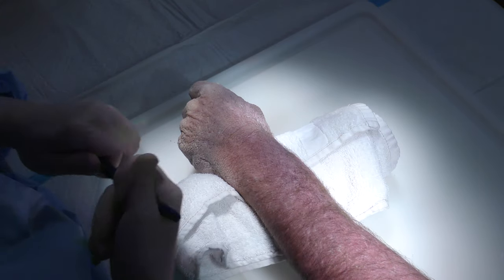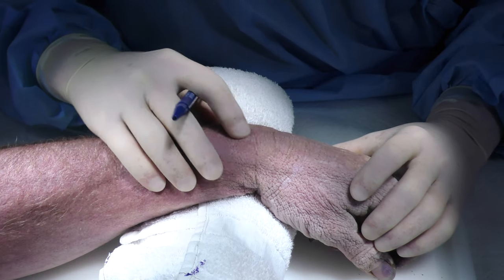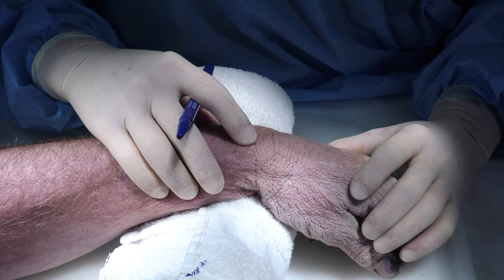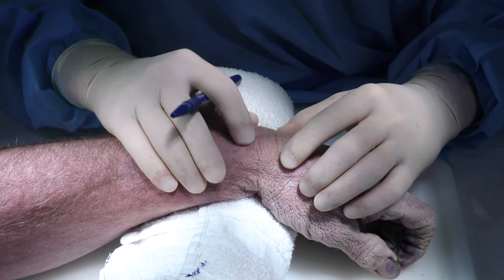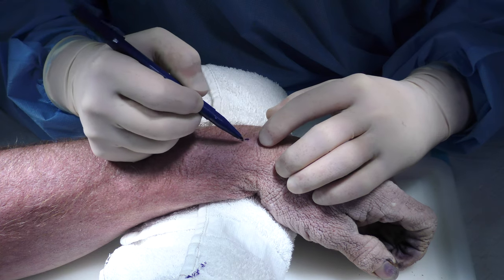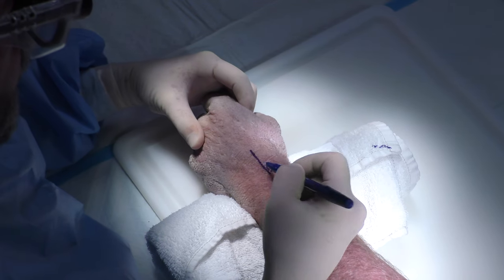So this is a dorsal approach for scaphoid fixation with the Acutrak screw, and topographical anatomy is always important. You feel for Lister's tubercle, and you can even feel for the EPL tendon right distal to it. So this is Lister's tubercle. You're going to be exposing the scapholunate interval. You want to come a little bit ulnar to it.